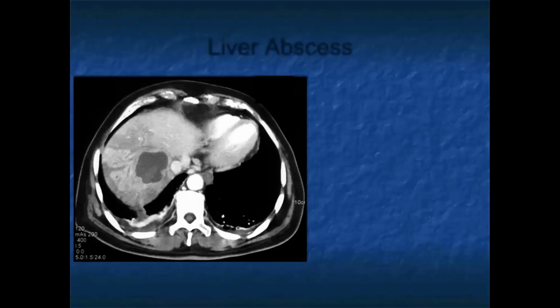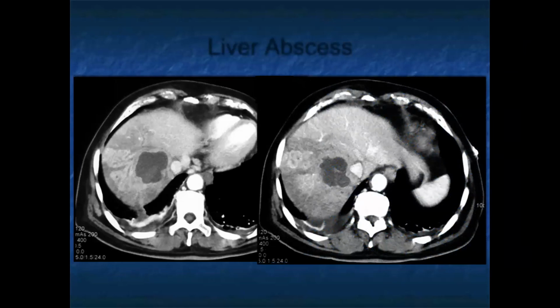Now, in terms of things that also can be cystic, liver abscesses are one of them. Depending, amoebic abscess, classically right lobe of the liver. The difference between a simple cyst and an abscess is when you start doing some narrow windowing, you do see perfusion changes within typical abscesses in the liver. So you can see all of the perfusion changes in the right lobe of the liver here. You also see the irregularity of the cystic lesion, and that was a liver abscess, that was E. coli.